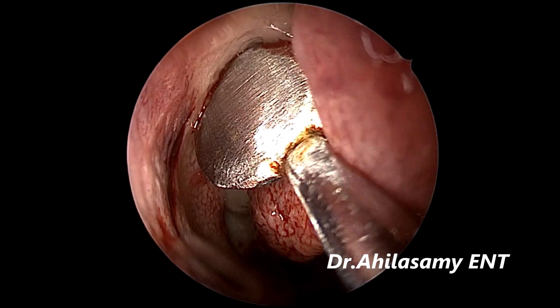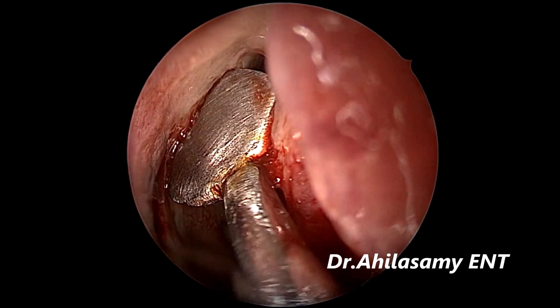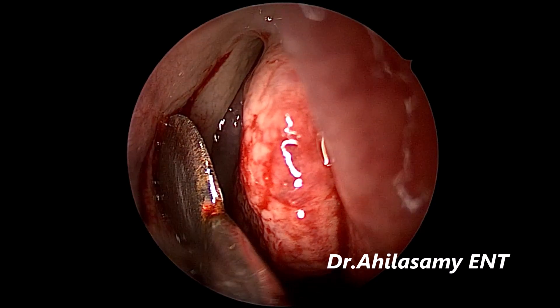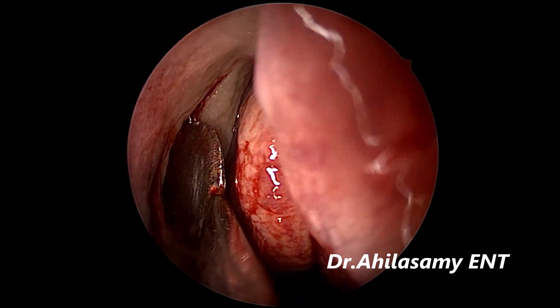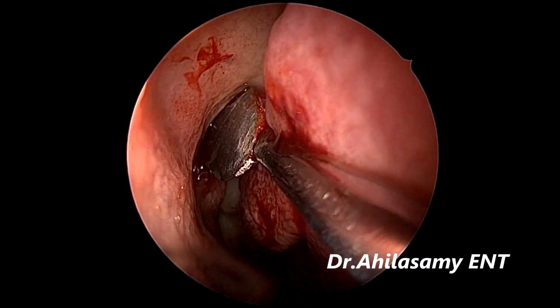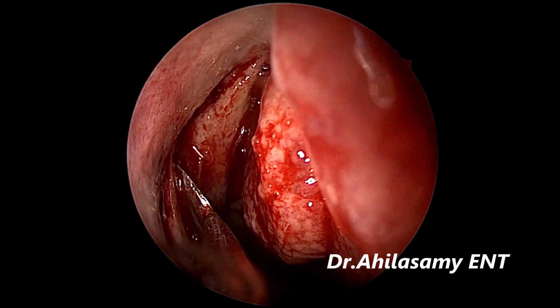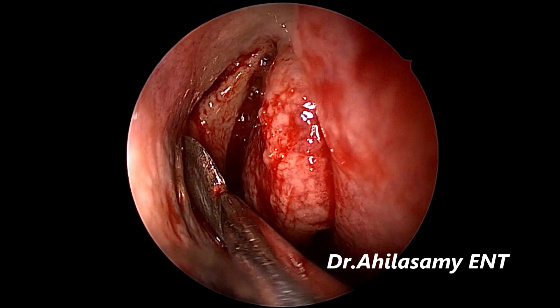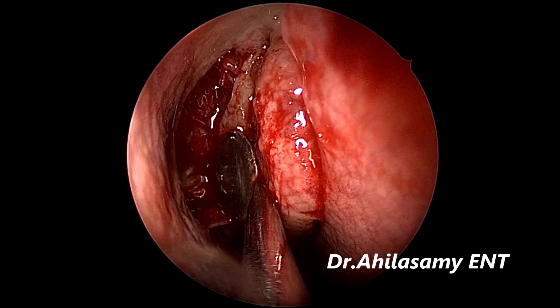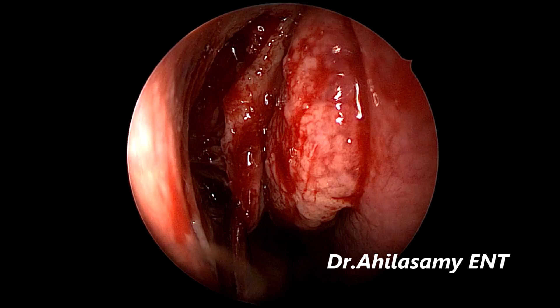Again using my own design, Dr. Ahila's Uncinate Dissector, to take out the uncinate on the right side. You can see the concha bullosa has been crushed and reduced to a normal-sized middle turbinate. The uncinate is being dissected from its attachment to the lateral wall, and in one stroke you can go down into the middle meatus to take out the anterior portion and open the inferior attachment.